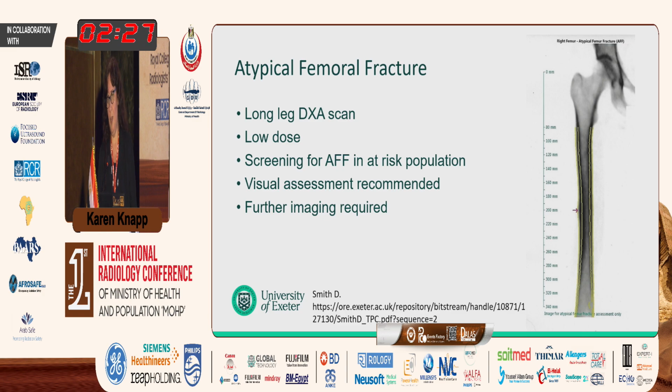So the final addition which we can have on our DXA scan is to look for atypical femoral fractures, and these happen in patients who are on bisphosphonates, generally for 5 or more years, and they occur due to oversuppression of bone turnover. And you can see on this here, about halfway down, we've got this little beaking in the cortex of the bone, and this is an incomplete atypical femoral fracture.